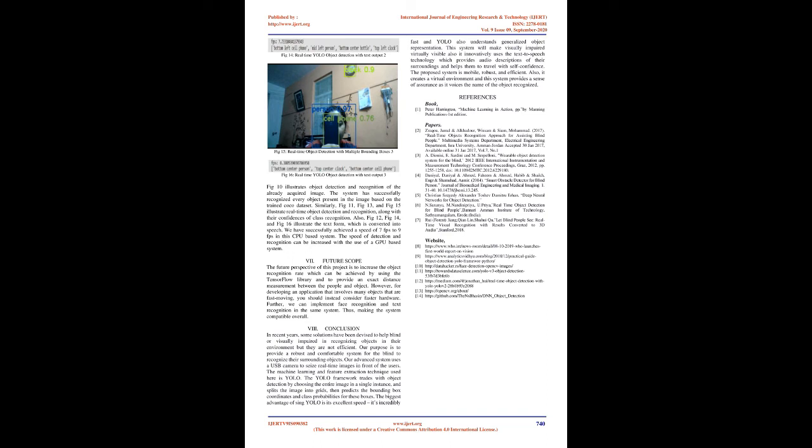Our system aims to produce an audio output for the visually impaired. The detected object labels are converted into speech using the pyttsx3 library. Lastly, upon successful recognition of an object and as per grids, the system will provide speech output stating the name of the object along with its grid name, for example mid-left car, mid-right car. Hence helping the visually impaired people in recognizing the objects in the field of view. Division of image into grids. Real-time YOLO object detection with text output.